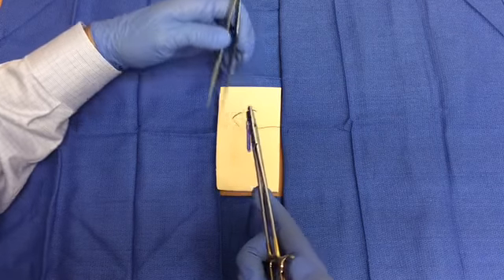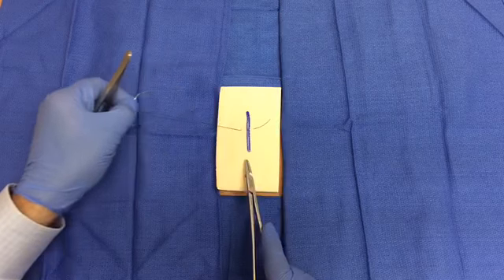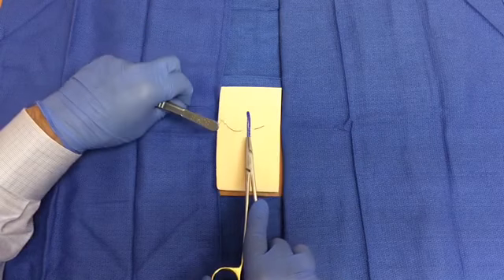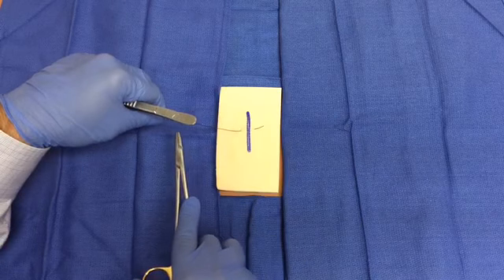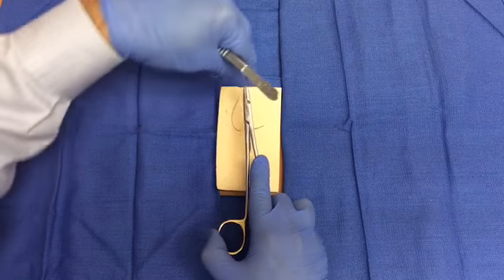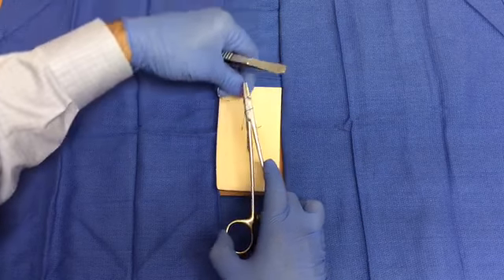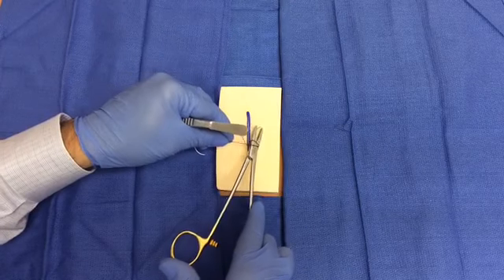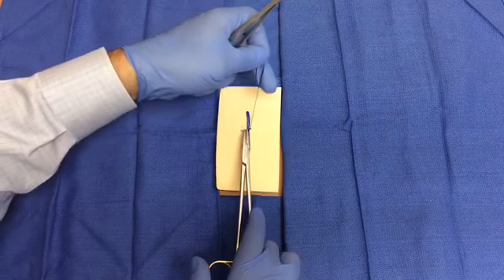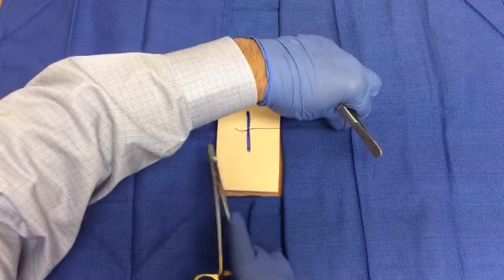At this point you may place your forceps down or practice holding on to them as you complete the instrument tie. Pull the suture material through the wound gently to create a short tail on the right side, which may be the patient's left side if he or she is supine. Note there is now a short strand and a long strand of the suture. Hold your needle driver parallel to the wound in the middle of the two strands. Lift the long strand up over and around the instrument to create one loop for a square knot and two loops for the first throw of the surgeon's knot. Open your needle driver and grab the distal aspect of the short suture tail. Pull it through the loops and then cross your left hand over your right to lay the first throw flat. We have recreated the short and long strands of the suture, though now they are on opposite sides.